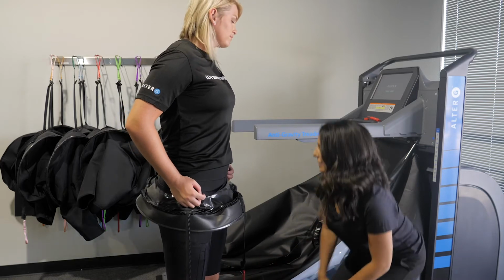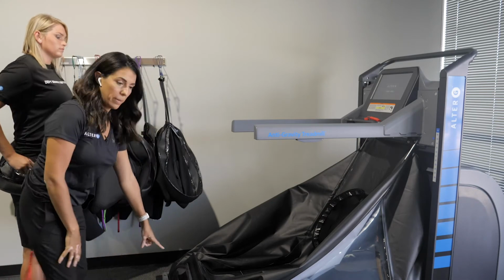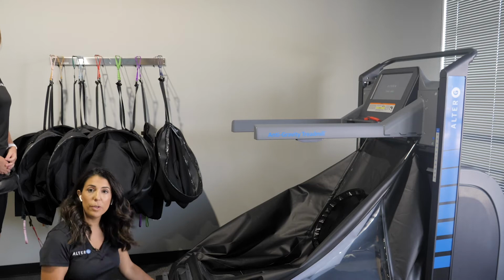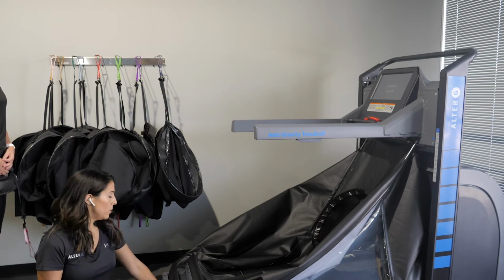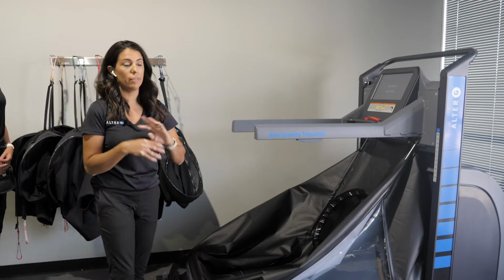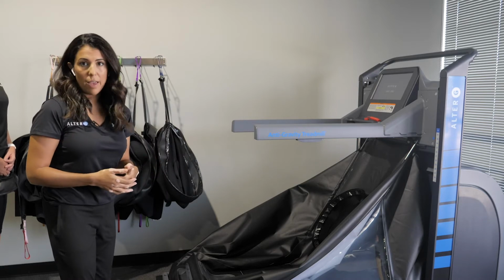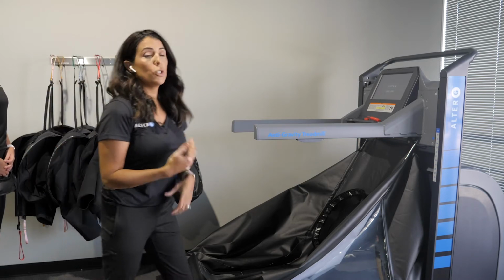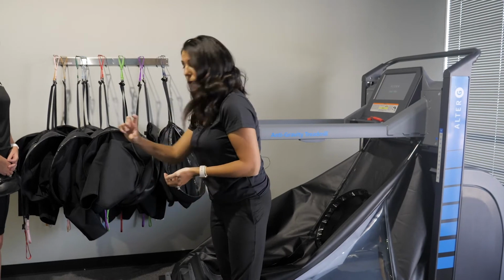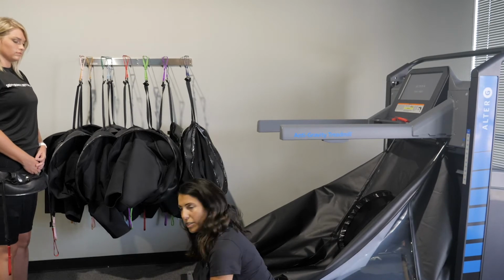All right. So what you can see with the new model Via is that we have a low step-up height. So what used to be a higher height on our M320 unit, if you're familiar with our older unit, with this new model, we have a much lower step height, which makes it a lot easier for patients of different functional levels to get in and out of the machine. We can still modify that. So if the 6 inches is still too high for your patient, or if they're partial weight bearing, we could put a smaller step, so that you step onto a 4-inch step and then you continue to step into the treadmill.